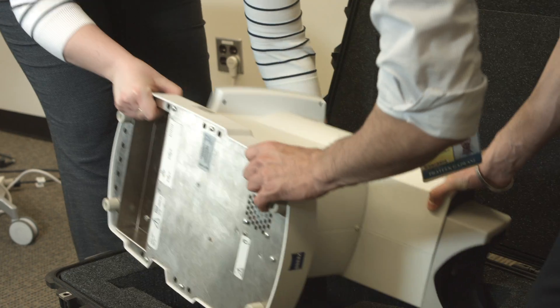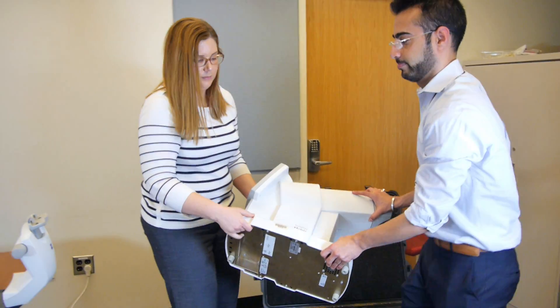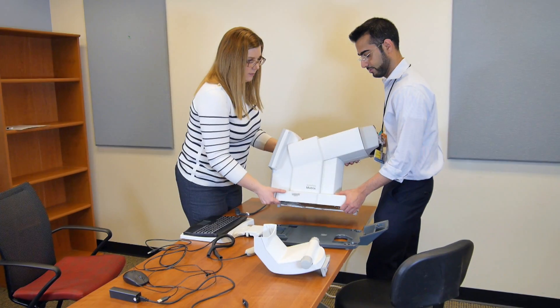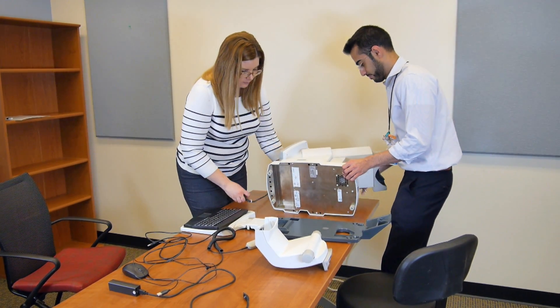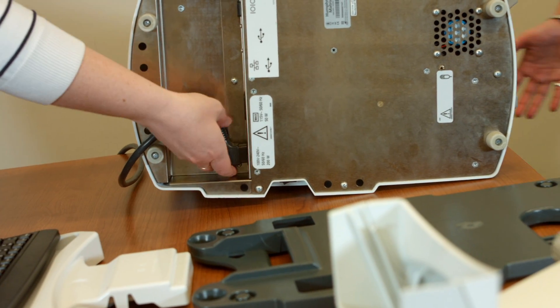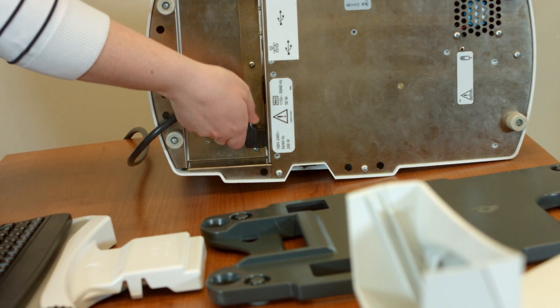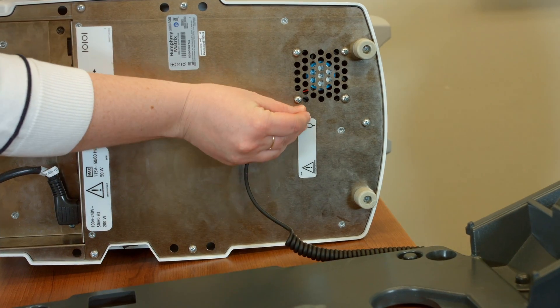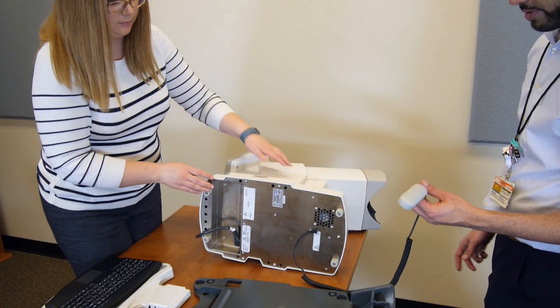Two staff members should pull the instrument from the case to make sure it isn't damaged. Lay the instrument on its side, being careful that the patient visor isn't in a position that will cause it to support the weight of the machine. Plug the approved power cord into the input receptacle on the instrument. Plug the clicker into the small round connector jack underneath the center of the instrument.